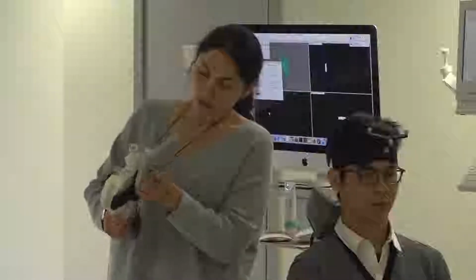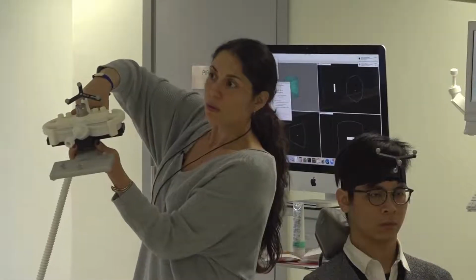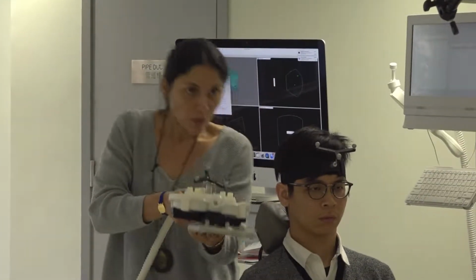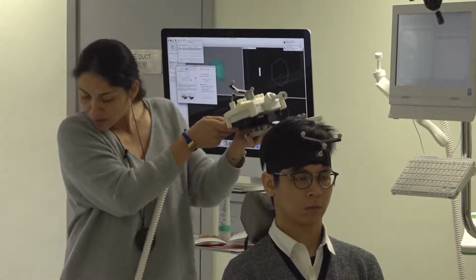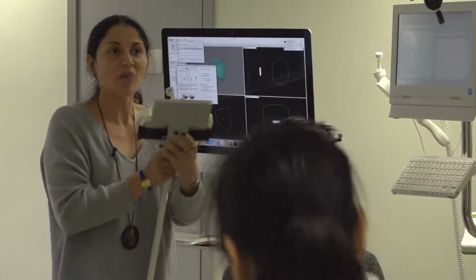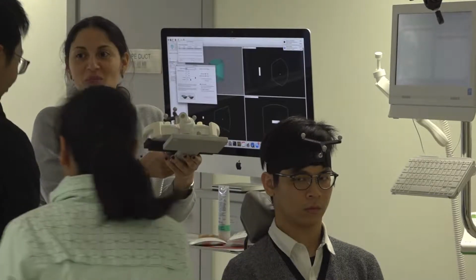What you will do is put the coil in the position of the mold. So that is here and is in view. When everything is in view, actually we did it differently yesterday. Let's see if I can. Sorry, but we don't have a holder and you need an assistant, somebody who can help you to hold something. Okay, thank you. I can do it.